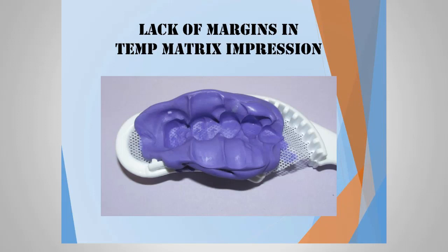Sometimes when we're using longer spans of crown and bridges, in this case tooth number 15, 14, and 13, a 3-unit bridge, getting that impression with the bite registration is almost impossible. So as you can see, not only buccally are we losing the impression, but also lingually.